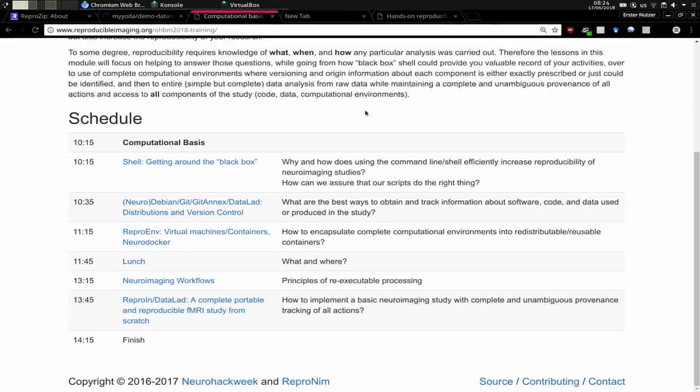So you downloaded a set of DICOMs and you were told that it was formatted or collected using the ReproIn standard. What the ReproIn standard really is about is taking DICOMs, or when you're at the scanner console, naming them in a particular way such that HeuDiConv, the tool that you use to convert them, can do an automatic conversion of those DICOMs to BIDS. Manual conversion of DICOMs to BIDS takes a fair bit of effort. You need to organize things in a particular way. By naming things right at the source, you simplify the conversion process.